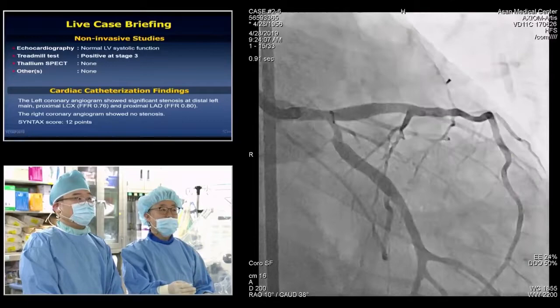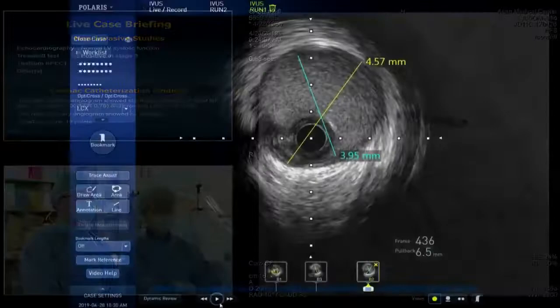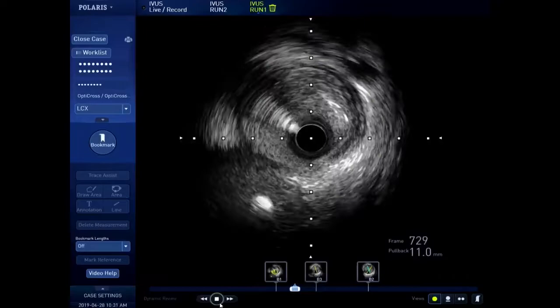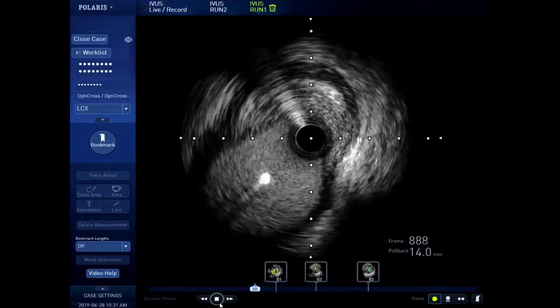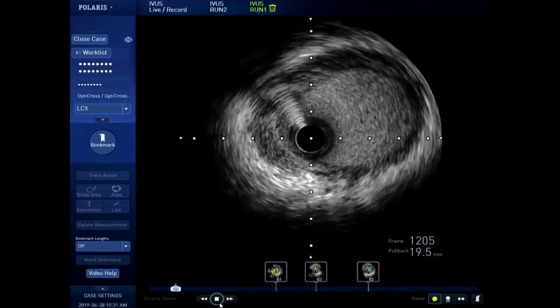We checked the IVUS from the circumflex to the left main. We're also going to check the proximal LAD to left main. Could you show the circumflex? This is the proximal circumflex, and the vessel size is 4.0. This is the stenotic portion, and there is huge plaque. This is the distal left main, and in the left main there is a huge plaque burden of more than 70%, and the atherosclerotic burden nearly extended to the main ostium, so we're going to cover the whole region.